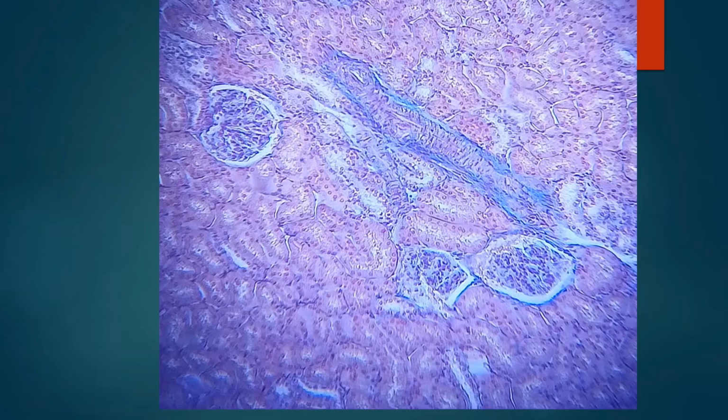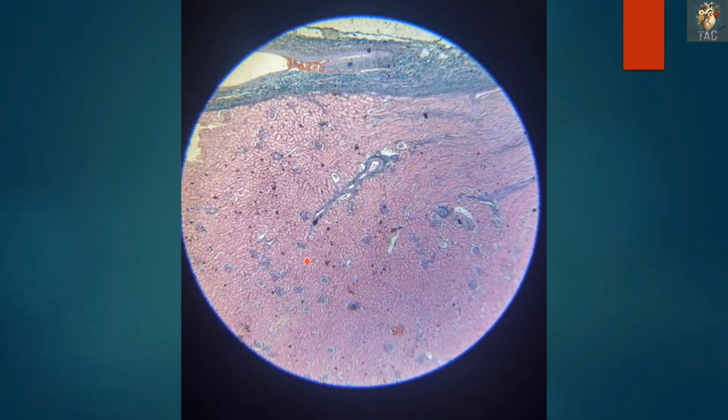This is another slide of the kidney at lower magnification, and in this you can appreciate a large number of renal corpuscles which are present. This is the connective tissue septa forming the capsule of the kidney, and this whole area is the renal cortex.